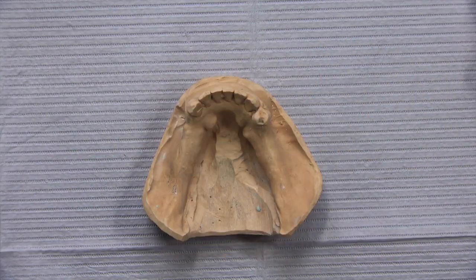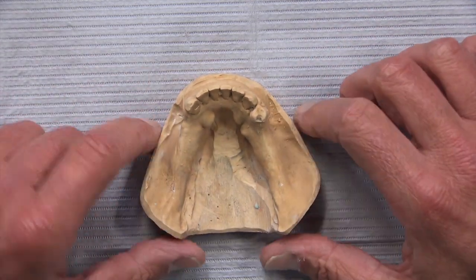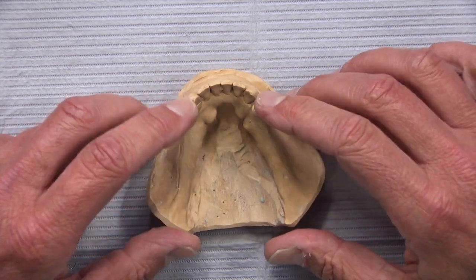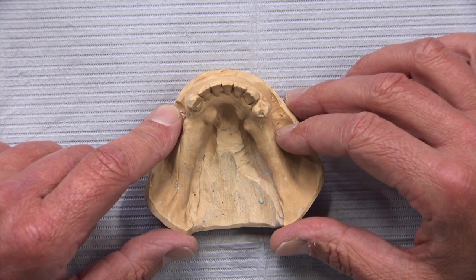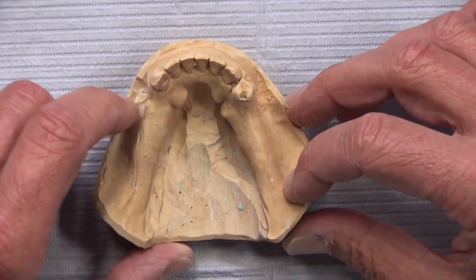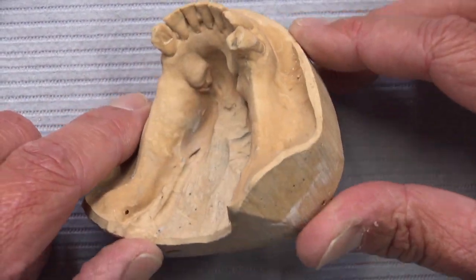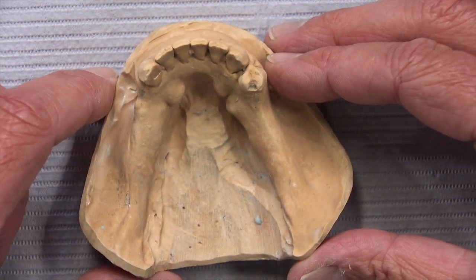I was in the partial department the other day and noticed an interesting case a doctor had sent in — a Kennedy Class 1 situation where we are edentulous bilaterally behind our remaining teeth. It presents some challenges because we've got some tori, at least three of them: one here and then two over on that side. We're also going to have some issues with clasp retention, especially on this tooth as you can see.